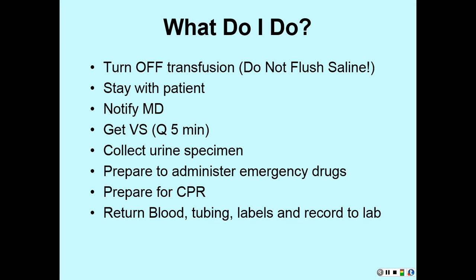Okay, but just regular old blood transfusion, you need consent, you need good identification, and you need the right setup, with the Y tubing. All right. Questions about that? Wow. No questions.